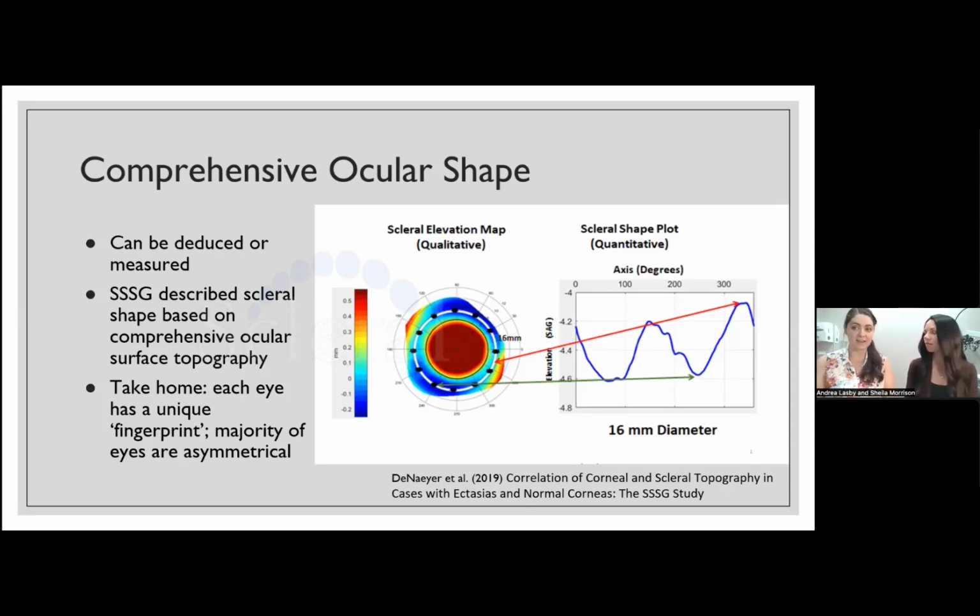So it gets you to your end lens faster. If it's possible for you guys to work with your manufacturers to actually get fit sets where you have toric right away, that's what I'd recommend. I would say I'm toric pretty much all the time at this point. And then we get into quadrant specific very commonly.